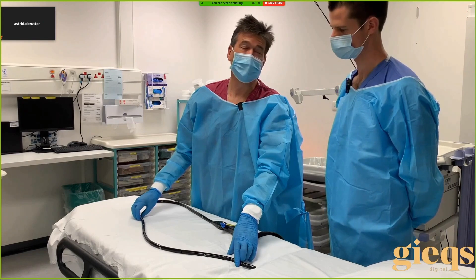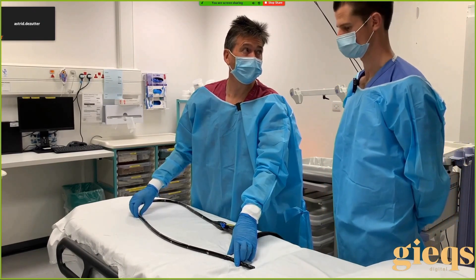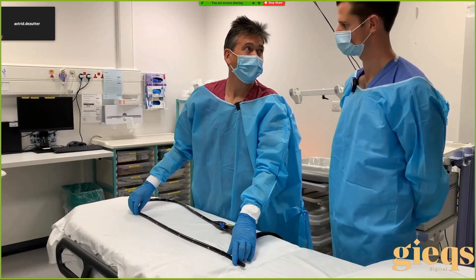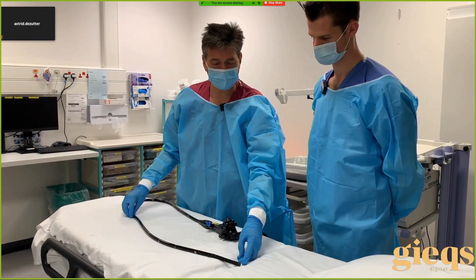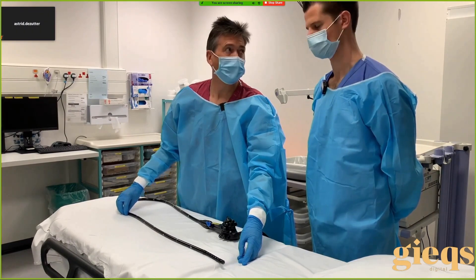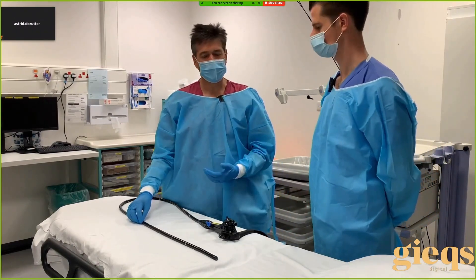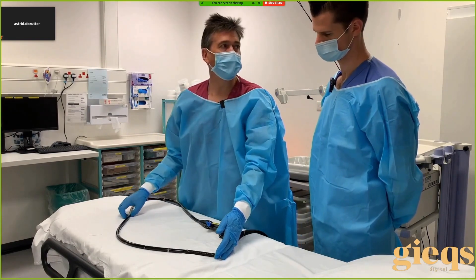'A little bit' is not a great description — we want to pull back until the scope is straight. How do we know it's straight? Watch what happens to the tip as I pull back — it doesn't move. And when it's straight, it starts to move back. So you pull it back till it's straight, because when you withdraw the instrument you're withdrawing it one-to-one.